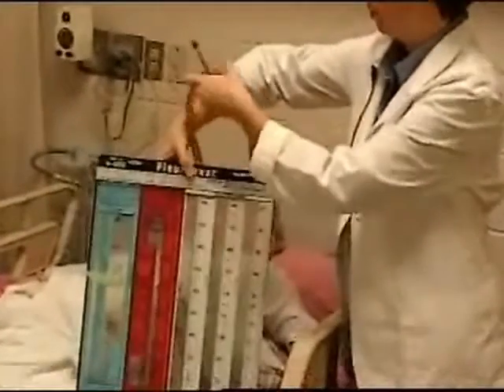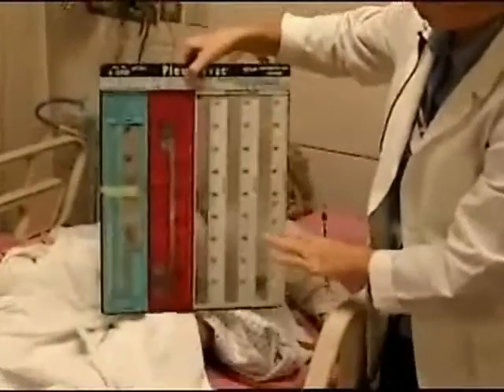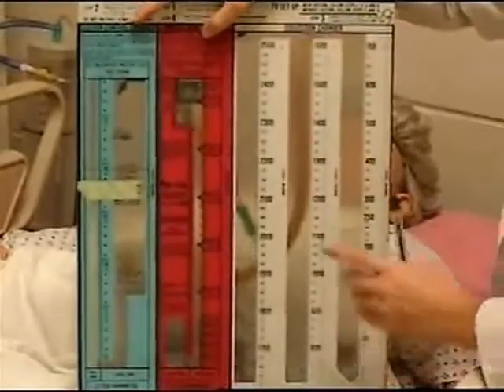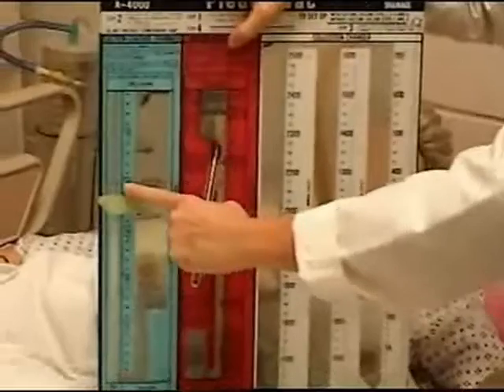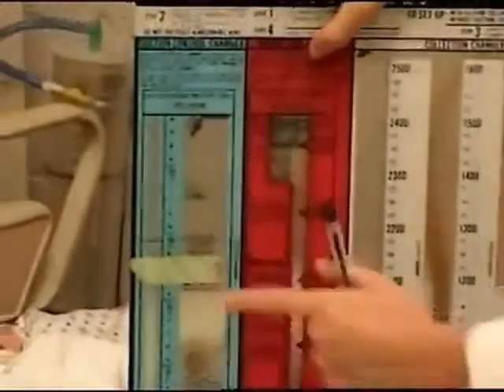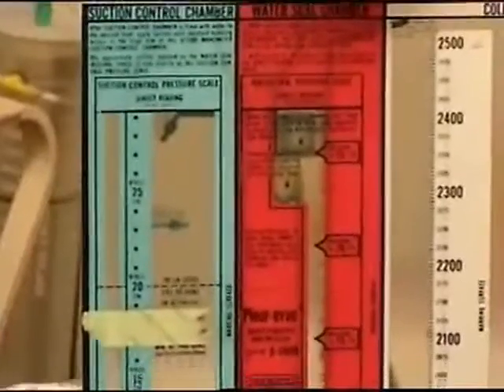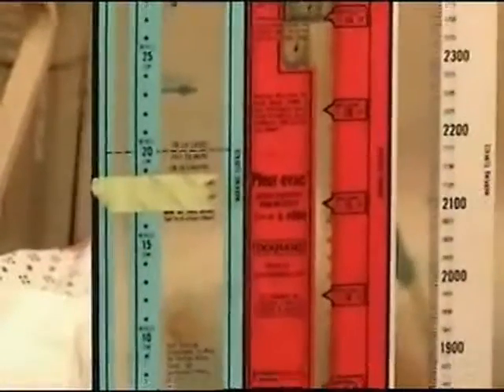And on the chest tube, there's three spots on this. The first one is the suction control chamber, and water is filled here to a minus 20 centimeters. This is the water seal chamber, and it's filled to 2 centimeter level. And this is for your drainage.